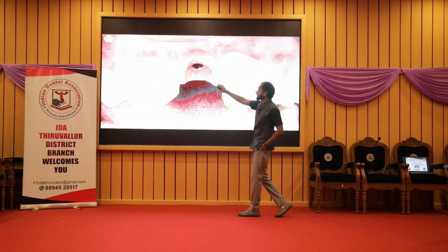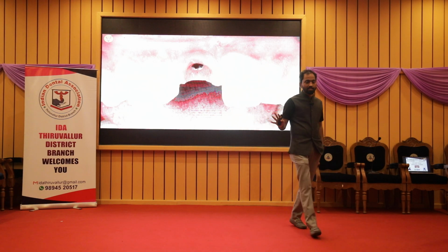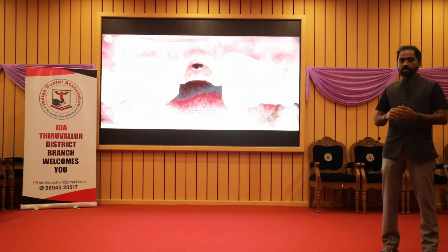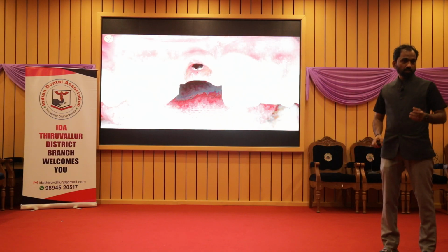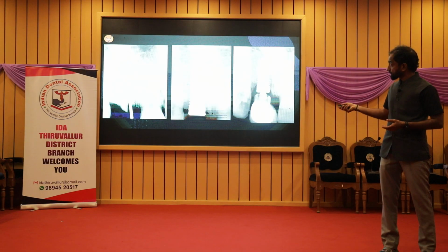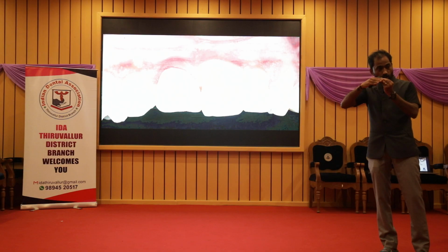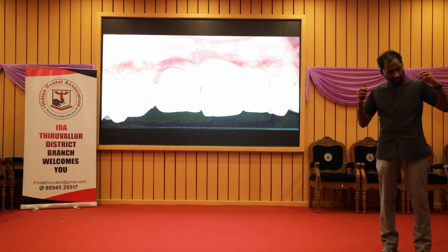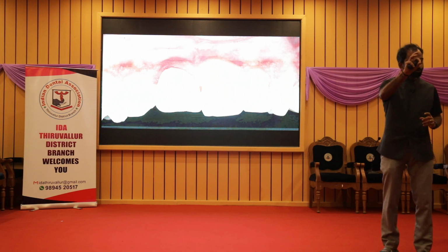And this is so, if you want to generate this shape, especially for the anterior region, the normal healing screw will not help you, because the normal healing screw will not have this shape. It will be round. So there you will have to customize your healing screws or your impression coping. In fact, for this patient, after extraction, I put a plastic abutment on the same tooth crown, because I got very good primary stability, and I placed the same tooth head into the socket.